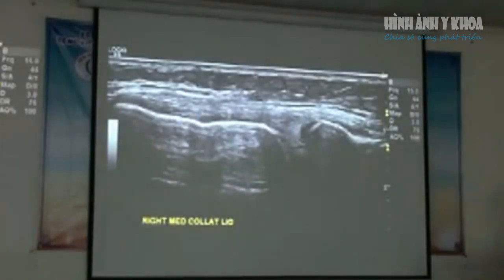So this is the image. So this is the proximal medial collateral ligament. So it's got a fairly broad footprint, and then you can see that normal echogenic, fibrillar structure going over the top of the medial meniscus. Dây chằng bên trong thì có điểm bám vào cái lồi cầu trong của xương đùi đầu trên và băng qua ở phía trong của cái sụn trên trong.